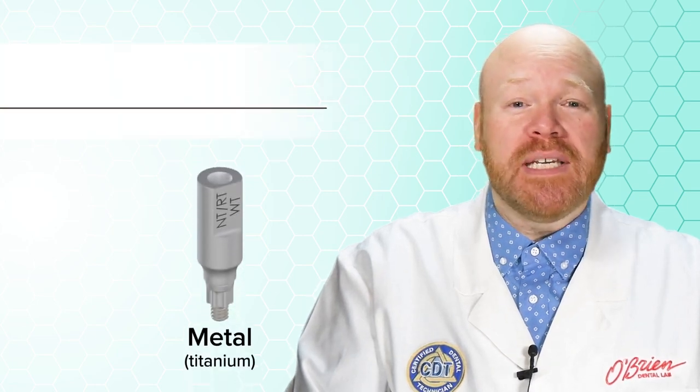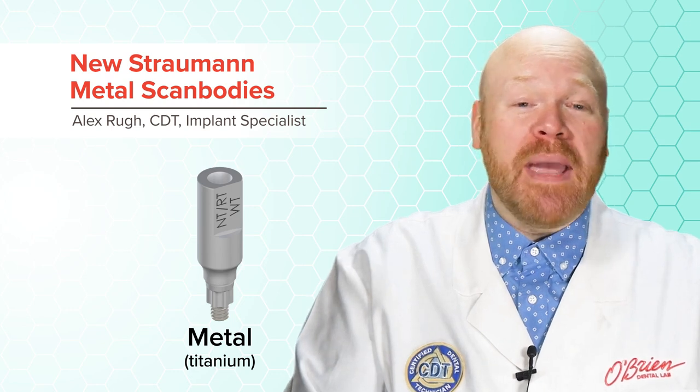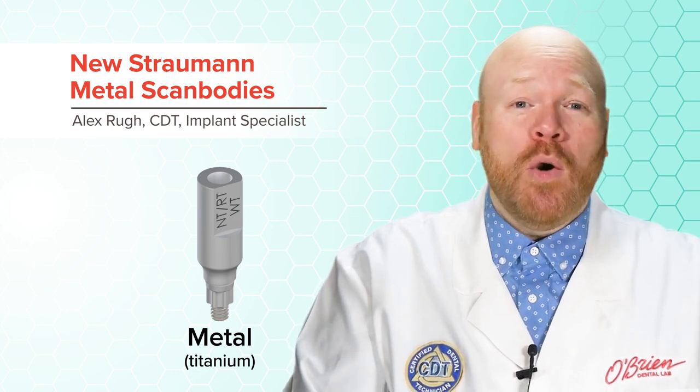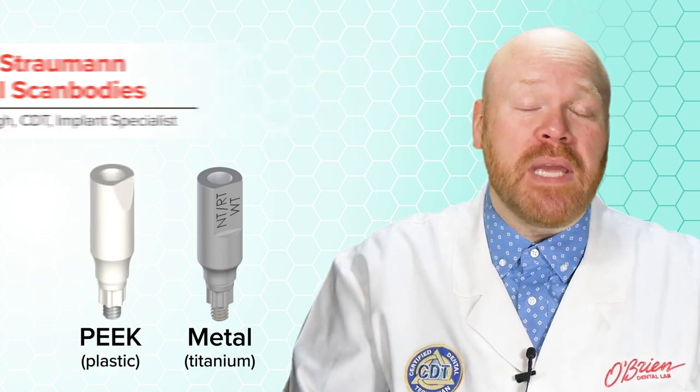Hey everyone, Alex from O'Brien here. This is a quick video to make you aware of the new metal scan bodies that were just released by Straumann early this year. These new scan bodies are made entirely of titanium, which is a big improvement over the previous version which was made of PEEK plastic.